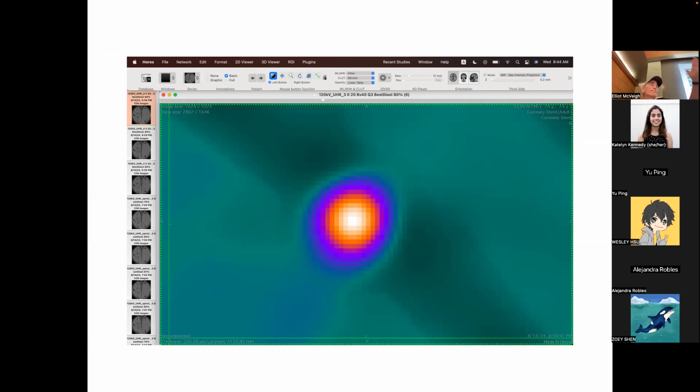So if I have a 30 keV photon versus a 120 keV photon, normally the spatial resolution of the system isn't changed. The spatial resolution of the system is very dependent on the sampling grid, not really on the energy of the photons. If you want to make a higher resolution CT scanner, make more pixels on your detector. But then you run out of photons in each bin eventually. You make them smaller and smaller and smaller, you just run out of photons.